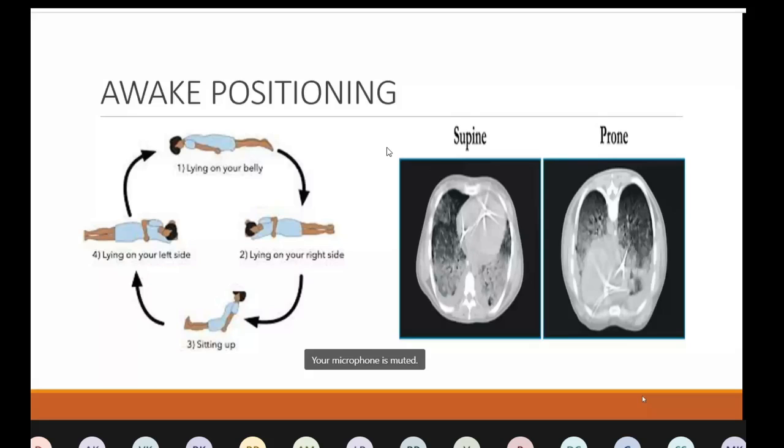But when we are not using a humidifier and heater, it can cause a lot of congestion and dryness to these patients. So use an HME. Or if the ventilator has a humidifier, fill the water in it. Do these things. If there's significant gastric distension, maybe you can consider putting in an Ryle's tube. Always, if a patient is at risk of aspiration, do not keep them on NIV.